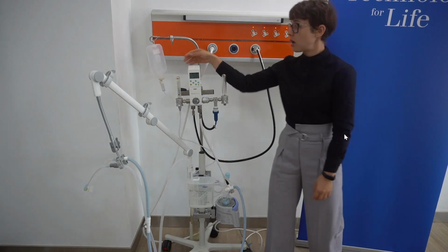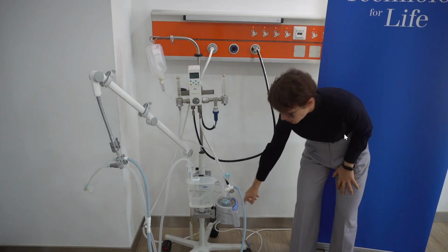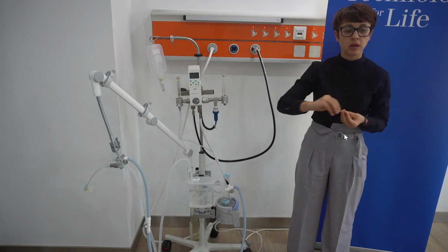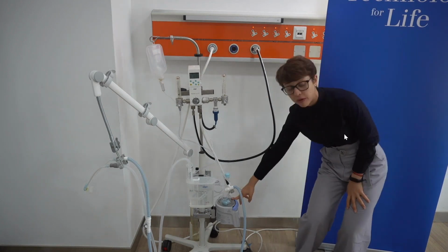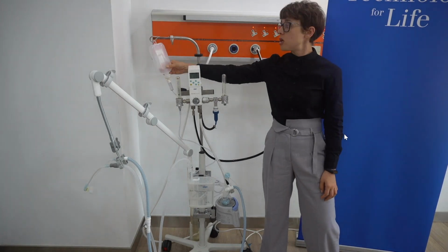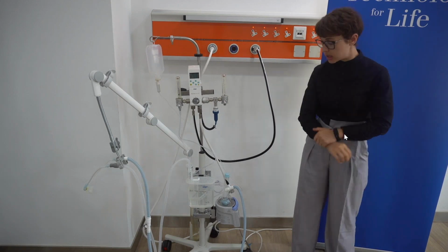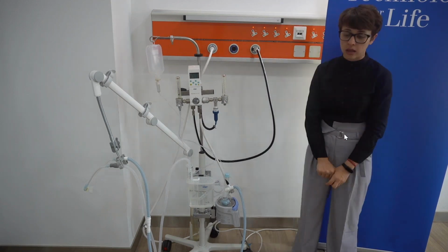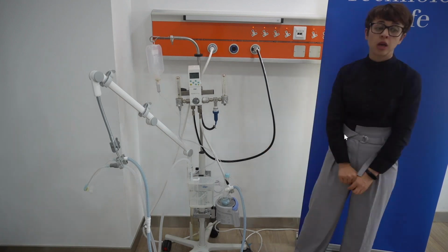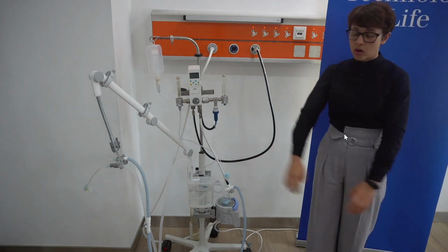During therapy, the water in the humidifier will evaporate, and in order to have the continuous delivery of water into the humidification compartments, we have this water drip bag. This can be your normal distilled water that is delivered into the humidification compartments for offering the humidity. So this is not part of the setup of the bubble CPAP.